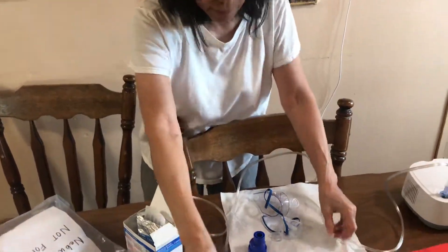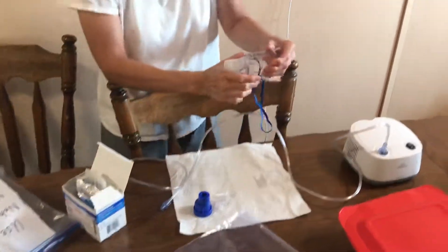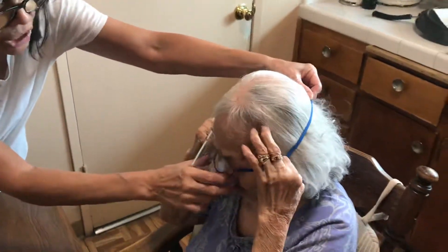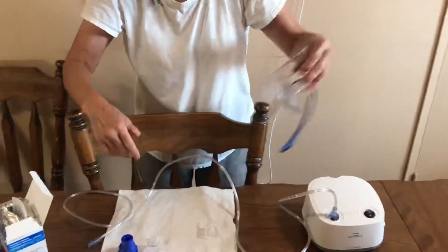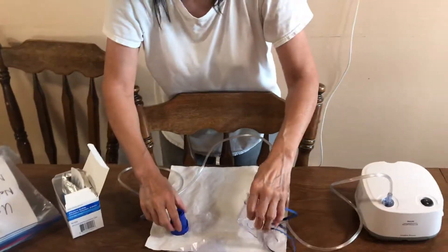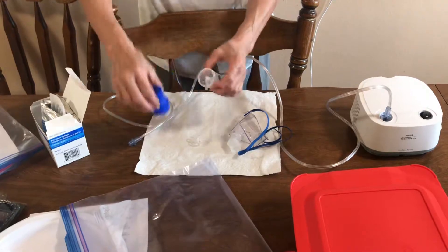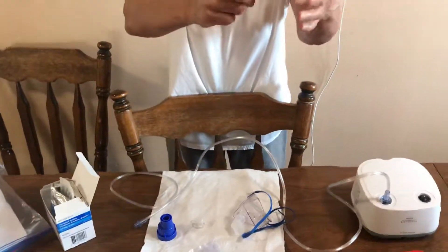First of all, I have to get this mask together. This is what mom uses — she puts it on her face like this, or sometimes she just holds it there. So that's the mask part. And this thing — you put the medicine in here like this.